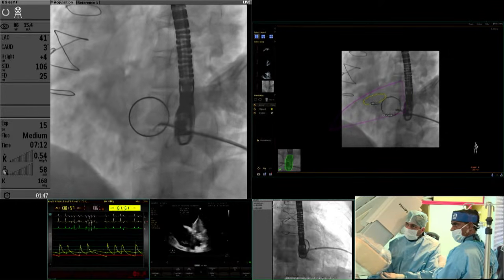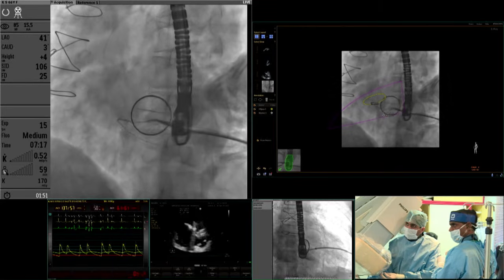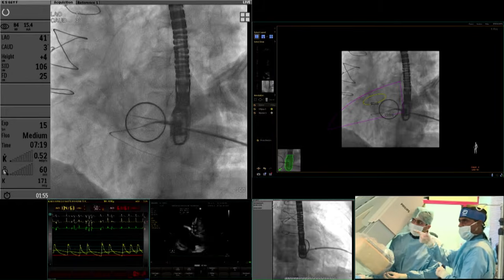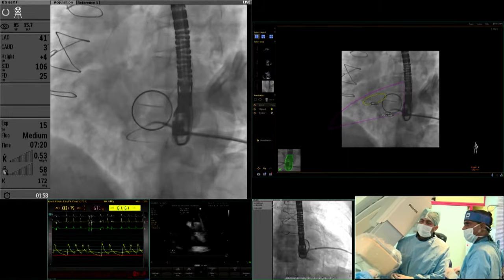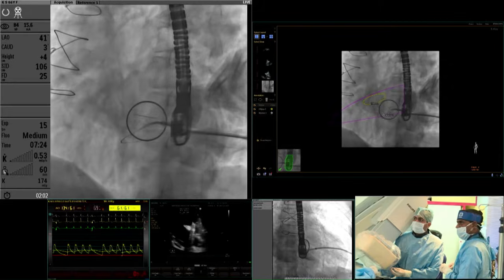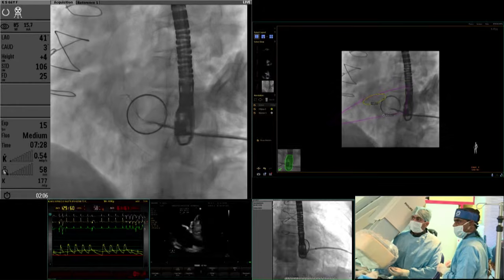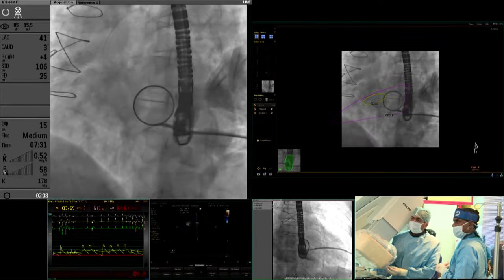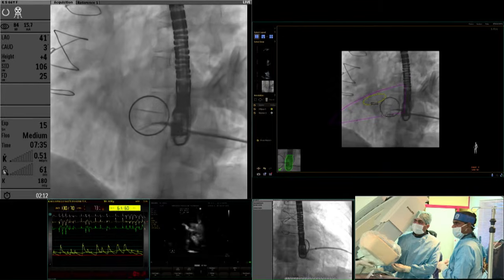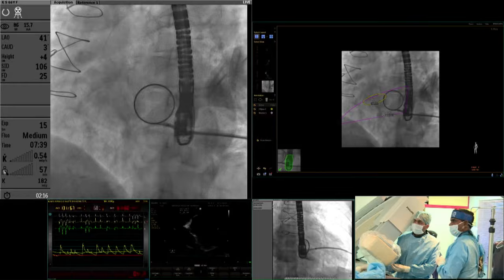So do you find the site based on the echo, and you are probing around there? Can you see on this marker that I am using echo navigation? Are you identifying a white marker there? Yes. Perfect. Sorry, we were not looking at it. On the left side of the screen is the regular fluoroscopy, and the right side is the echo navigation. Perfect. Now I am probably losing the.